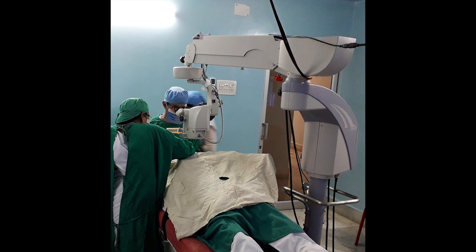Dear colleagues, today let me say something about the Ophthalmic Surgical Microscope. I am using the Topcon OMS-800 for the last one year and I am quite happy with it. Depth perception is very good. I use only 15 to 20% illumination. It is very soothing to the eye. It can be used for wear surgeries. It comes with an inbuilt beam splitter, XOI, and continuous zoom. Price is around 20 lakhs.